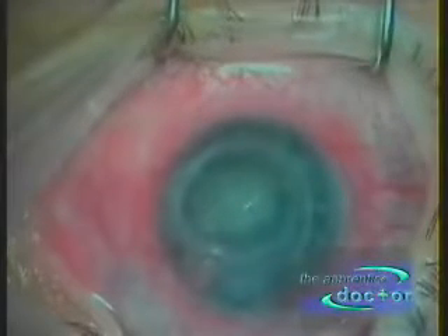Would you like to see very fine suturing craftily performed by an eye surgeon? This cornea has lost its transparency due to recurrent eye diseases, and this patient is effectively blind in this eye.